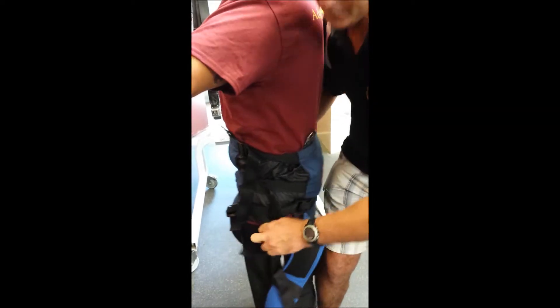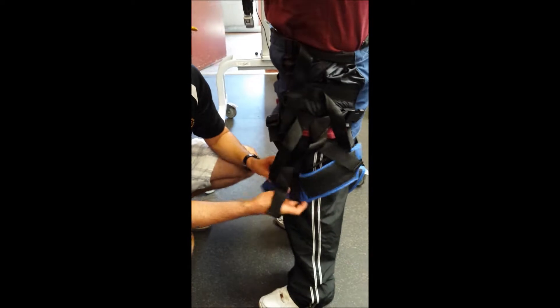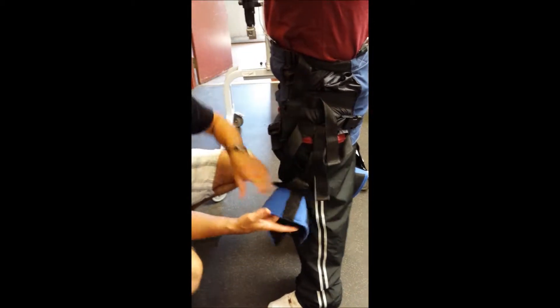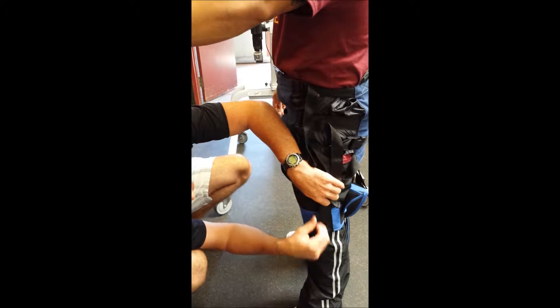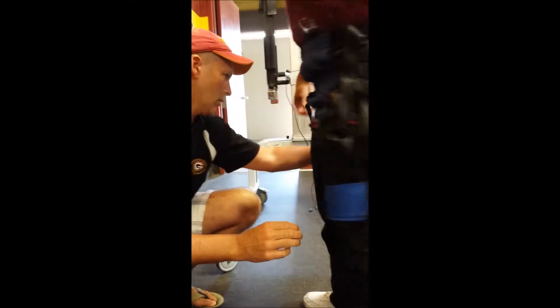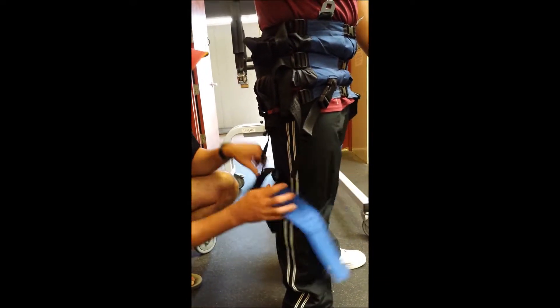The more snug I put it on, the less it's going to ride up on Tim when he actually uses it. The harnesses we have set up right now include a leg strap. There are a couple of different arrangements from Mobility Research — each one has its pros and cons. There's another apparatus that has a tail that goes underneath, so this is a slightly different setup.